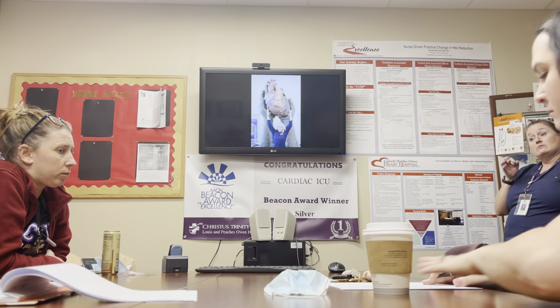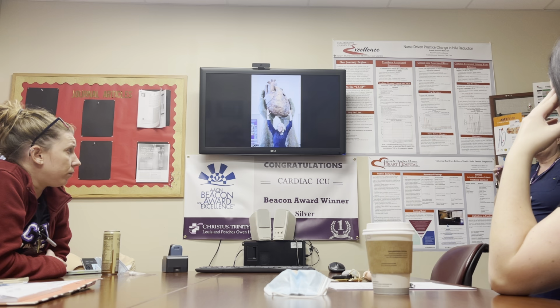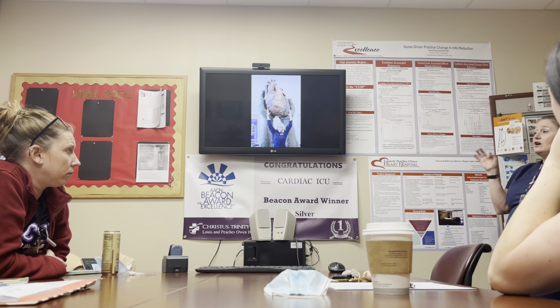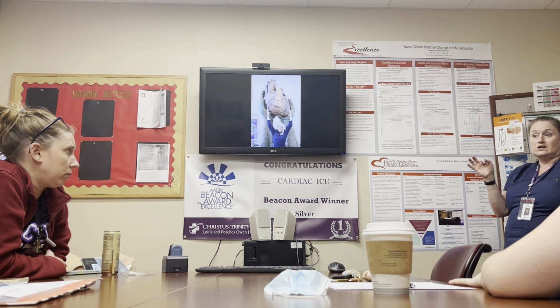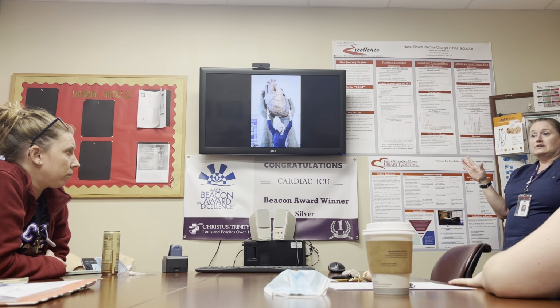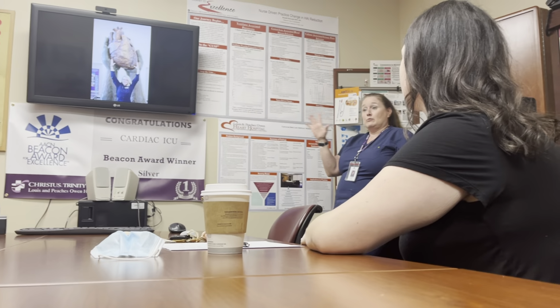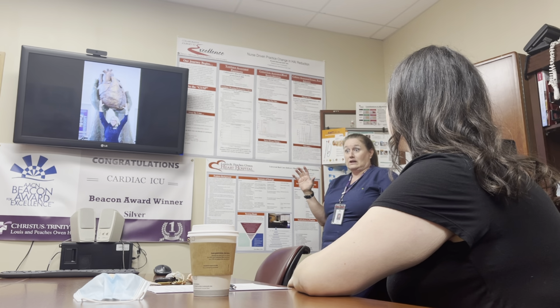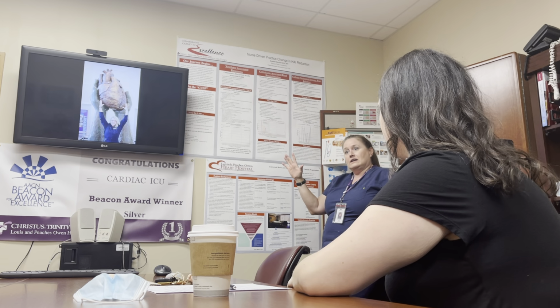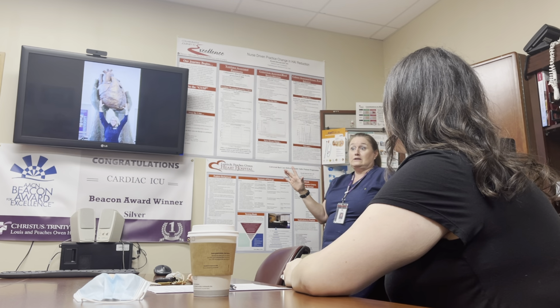If the patient is in extremis and we order a chest x-ray and we say, hey, take a look at the chest x-ray because we're concerned about a pneumothorax, you can at least see maybe there's air or maybe there's a shift or there's something not right in the chest x-ray. And then you can go from there. Again, I've been looking at x-rays since I started in medical school in the late 80s, so I've been looking at x-rays for a hell of a long time, okay? And I'm a pulmonologist to boot, so I had to look at x-rays to figure stuff out. I don't get it all the time, but I do know how to recognize quite a bit and when something's wrong and I need to do something about it.